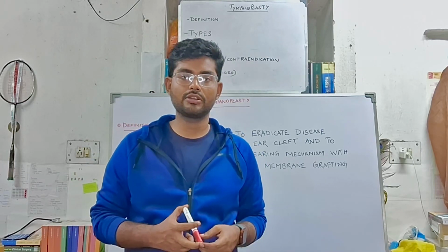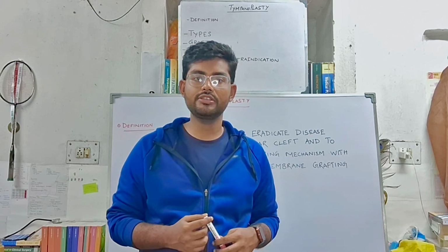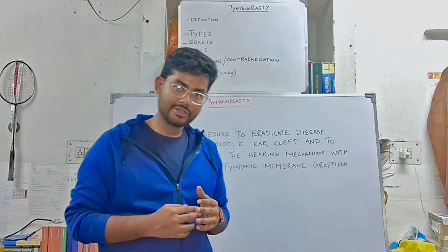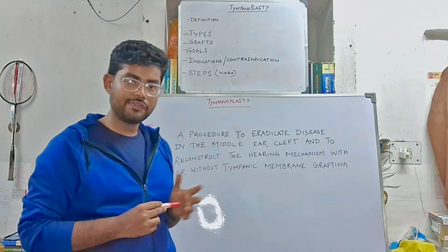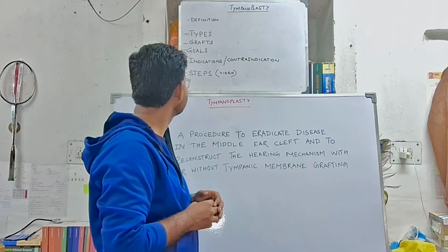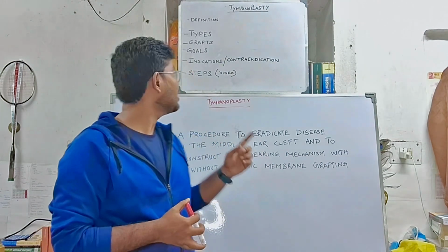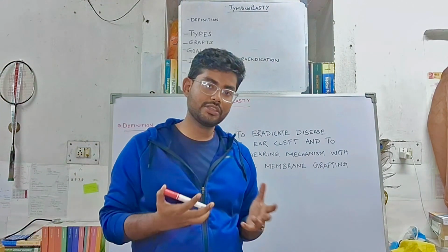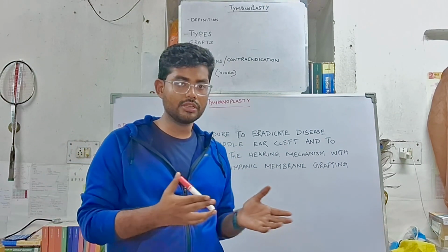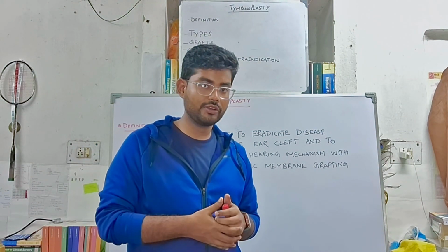Welcome everyone. The topic of discussion today is tympanoplasty. So the broad headings on which I will be talking about are definition, types, the grafts used in tympanoplasty, what are the goals of the surgery, indications, contraindications of the surgery, and finally I'll try to explain the steps as well as the use of the common instruments used in tympanoplasty with the help of a video.